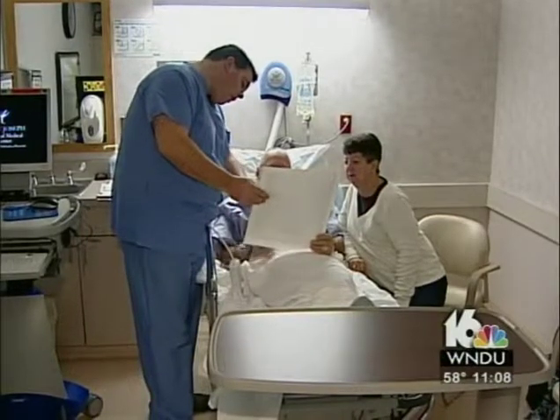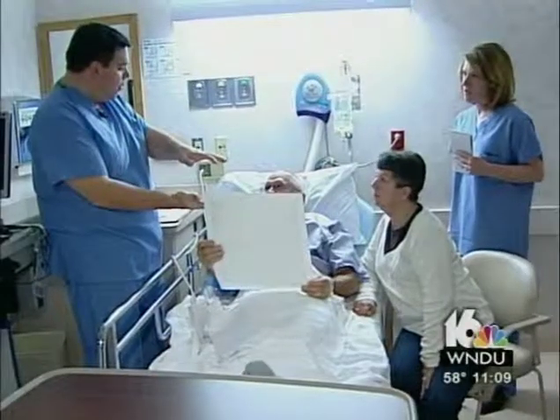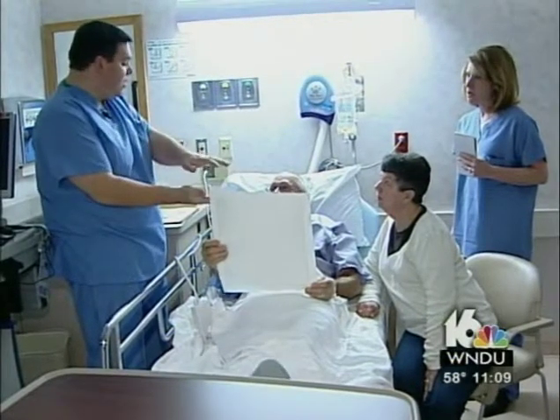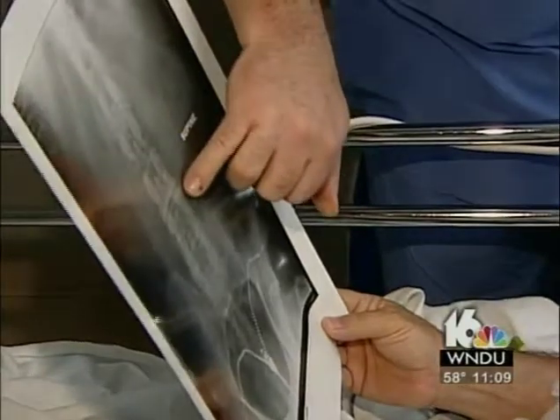And we're going to go in on your left side. He's going in for a procedure called extreme lateral interbody fusion. Because we want bone to grow through the middle of it. Most back surgeries are done through, well, the back. But George's back will be fixed by Dr. Thomas Mango, who will go through the side. It's funny, the name extreme sort of scares some people. It was a completely different approach.